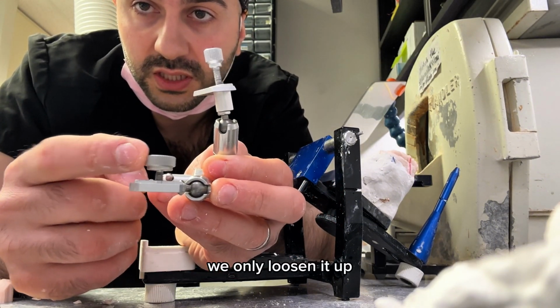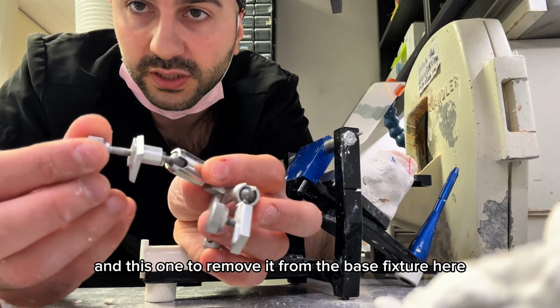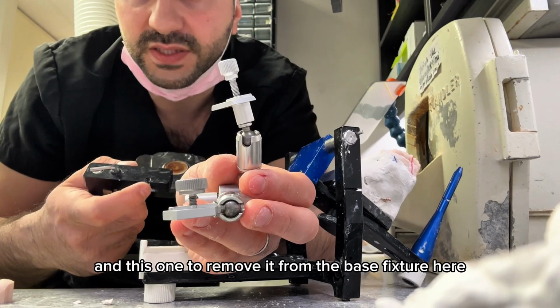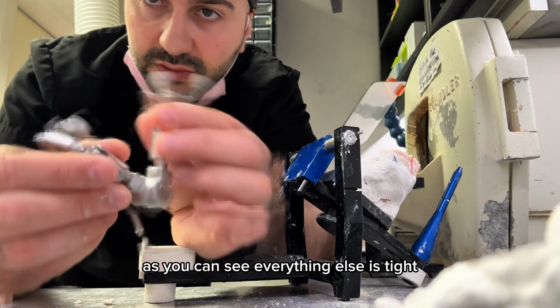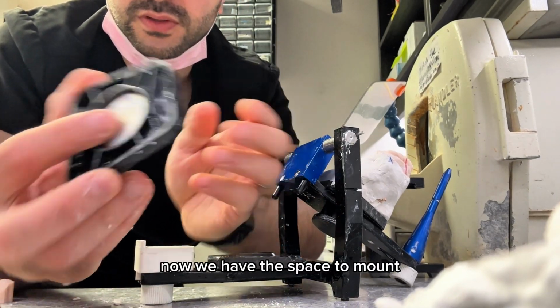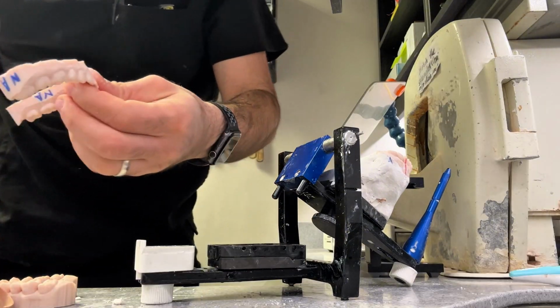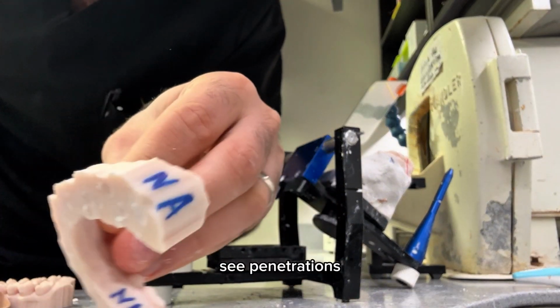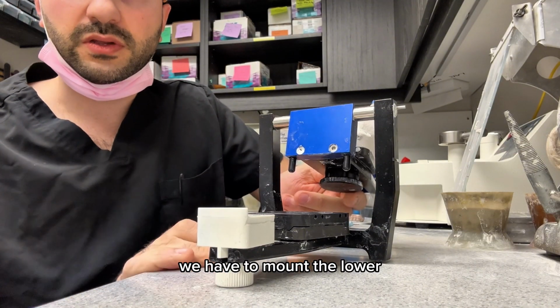So we're only loosening up this one to remove it from the fork, and this one to remove it from the base fixture here. I'm gonna put it aside. As you can see, everything else is tight. Now we have this base to mount. We have another one of those disposable ones. See, penetrations. We have to mount the lower.